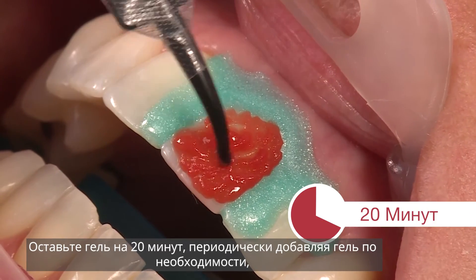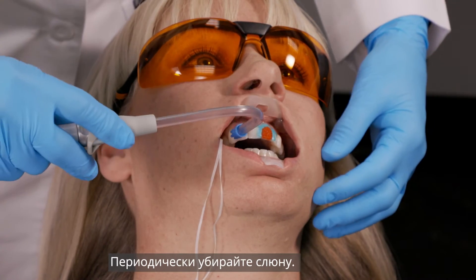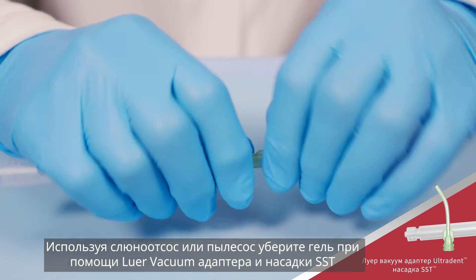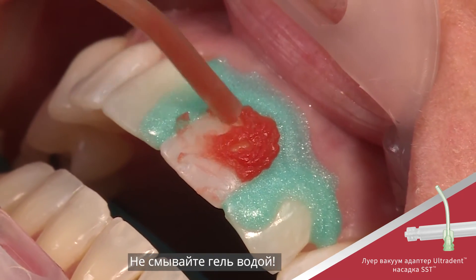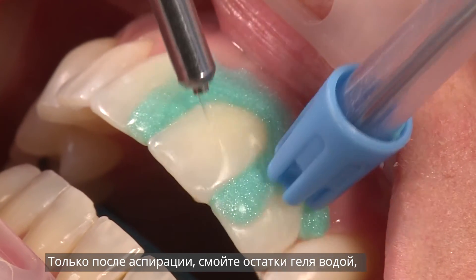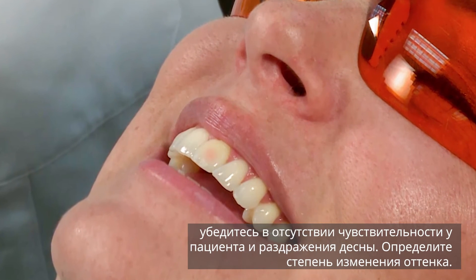Allow the gel to remain on the teeth for 20 minutes, checking and reapplying the gel to areas that have thinned or need replenishing. Periodically suction saliva with a saliva ejector as needed. Suction gel from teeth using the Luervac adapter and surgical suction tip. Do not use water while suctioning gel. Clear suction periodically with water, then thoroughly rinse teeth with an air water spray.